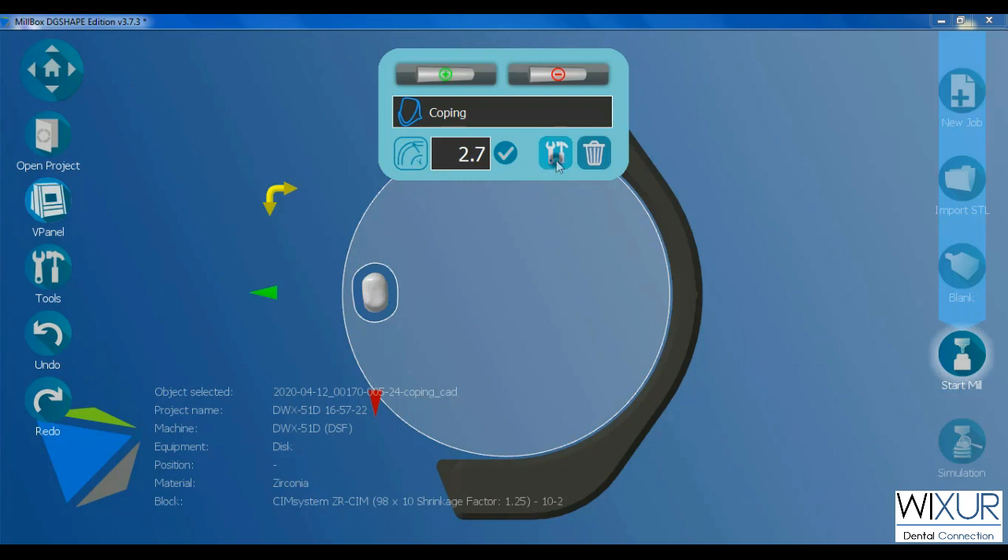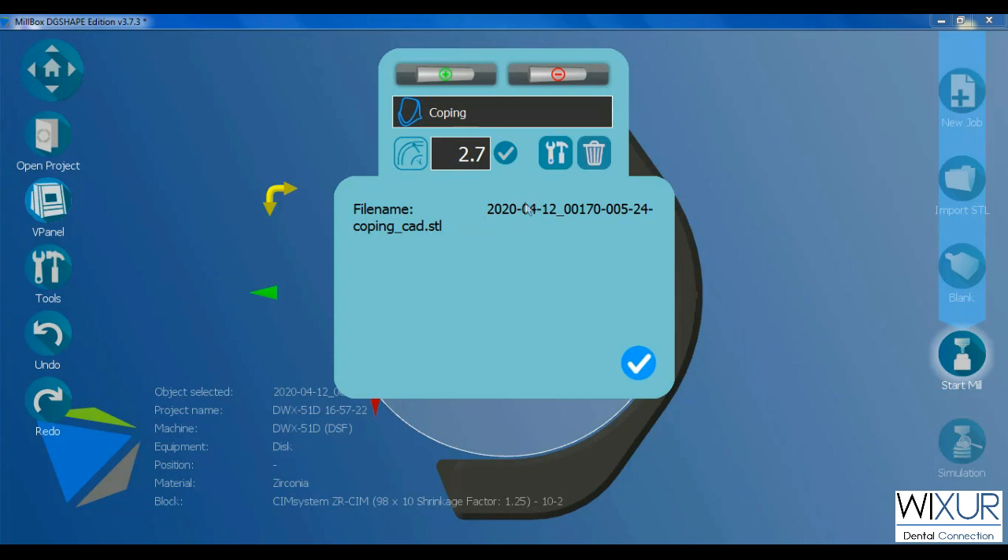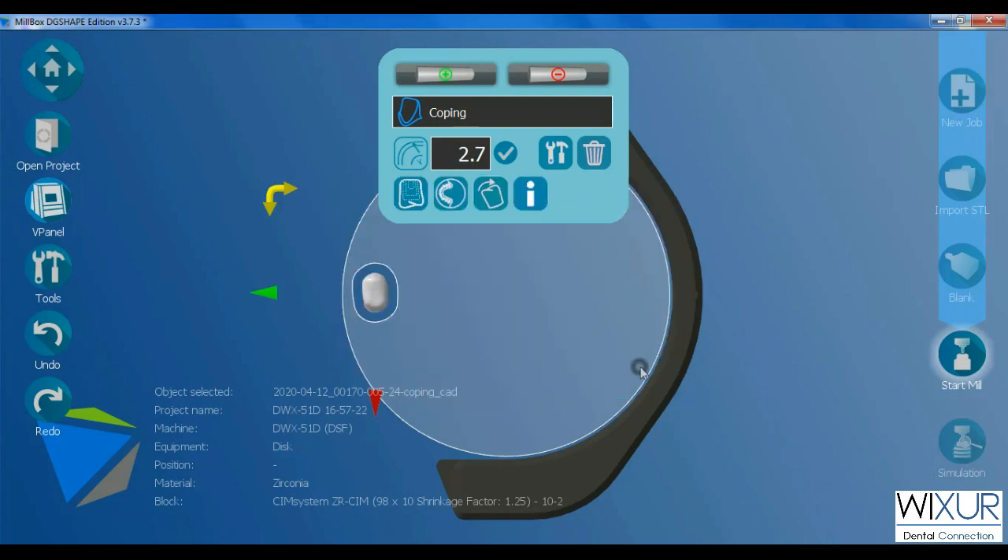Let's open settings. This button gives general information about the selected job — as you can see, the file name and the type of it. The next button is for rotating the job.